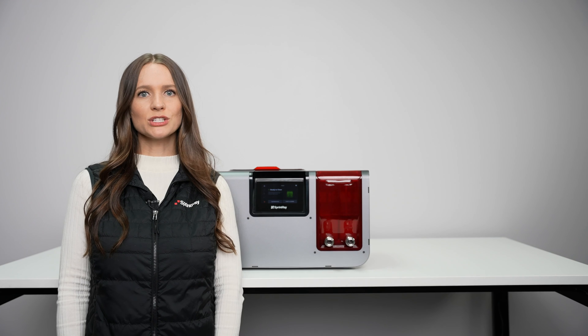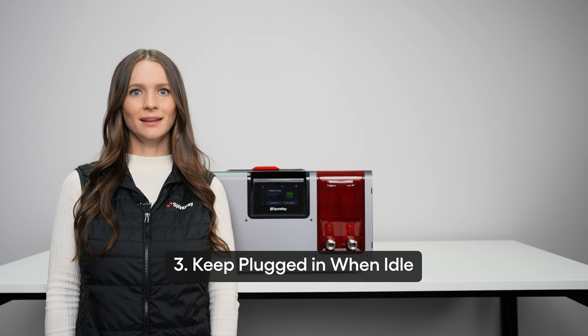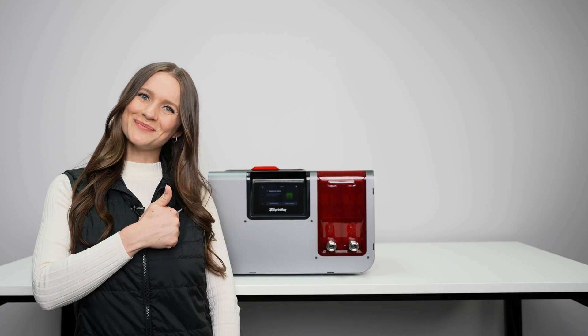If you're not going to use the ProWash S for a while, keep it plugged in with a fresh tank of IPA so that it's ready for use next time.